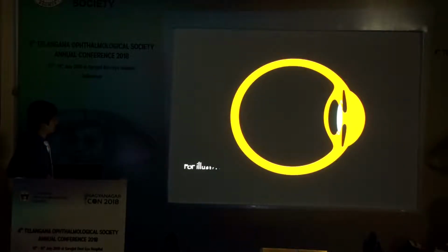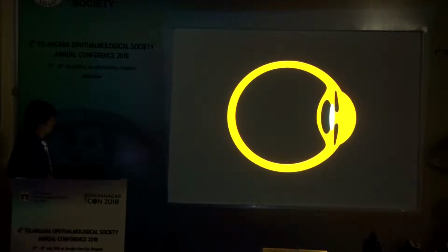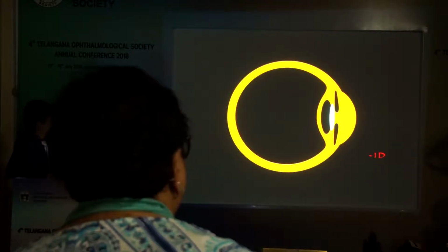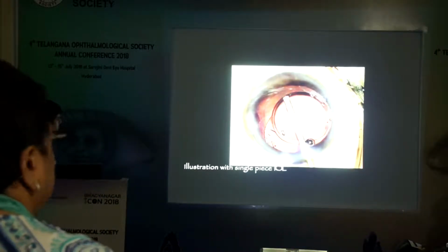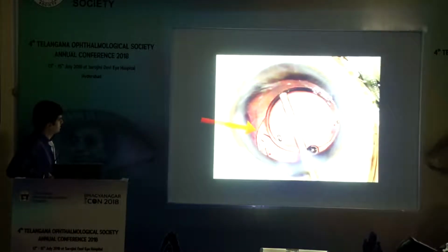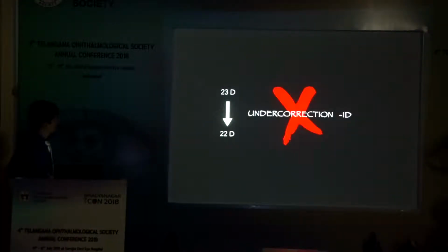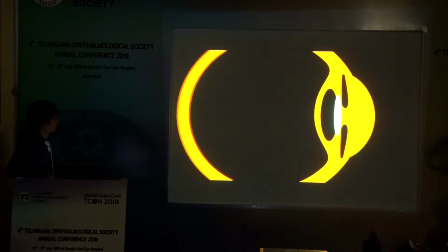iris. Moreover, placing the IOL in the ciliary sulcus would result in anterior shift of effective lens position. Therefore, the IOL power should be reduced by 1 diopter for an average sized eye. Furthermore, the IOL optic can be captured posterior to the rhexis margin to lock the IOL in its place, preventing future decentration and eliminating the need for adjustment of IOL power for sulcus placed IOLs. If the capsular rhexis is compromised with inadequate capsular support, the decision of IOL implantation would be governed by the status of iris tissue support.